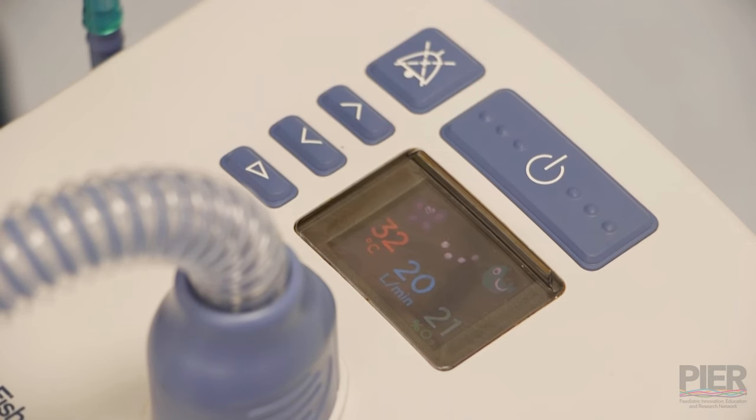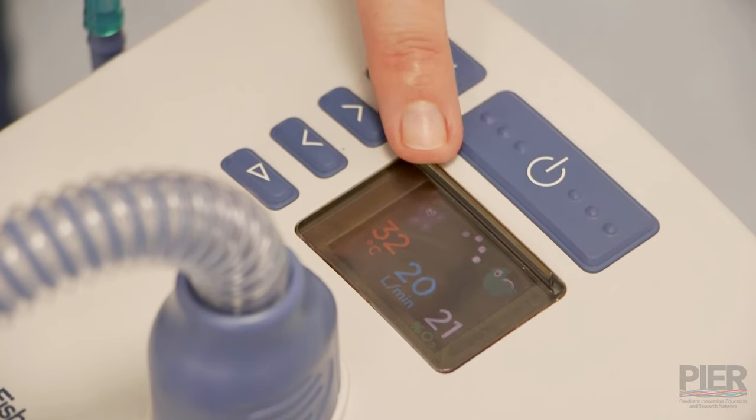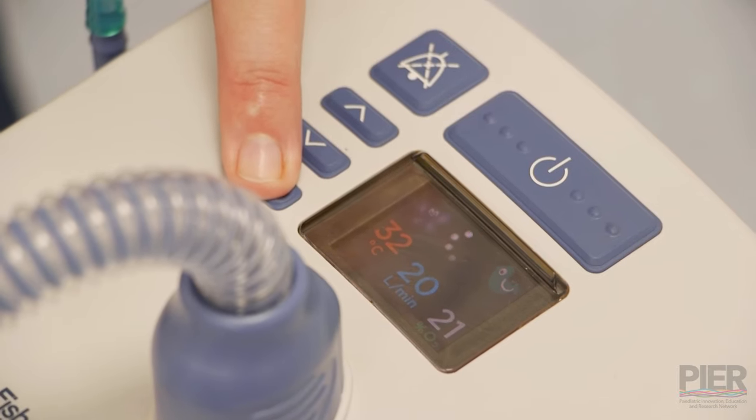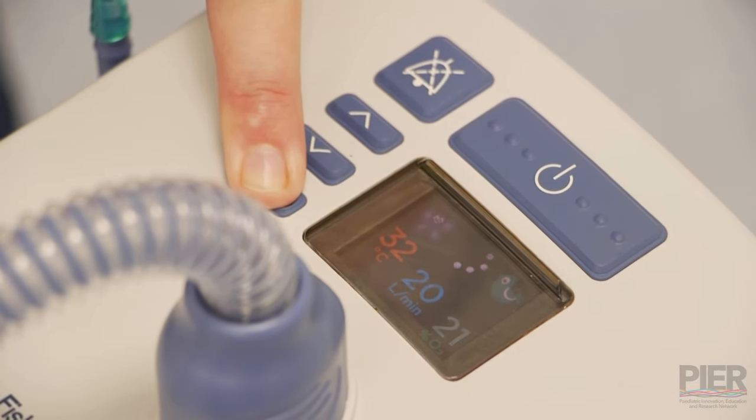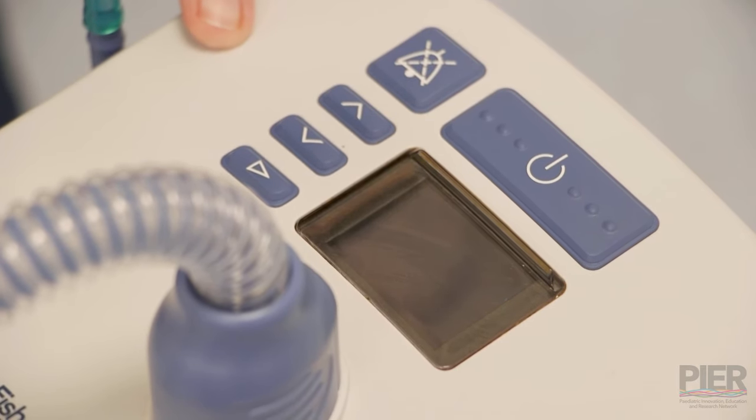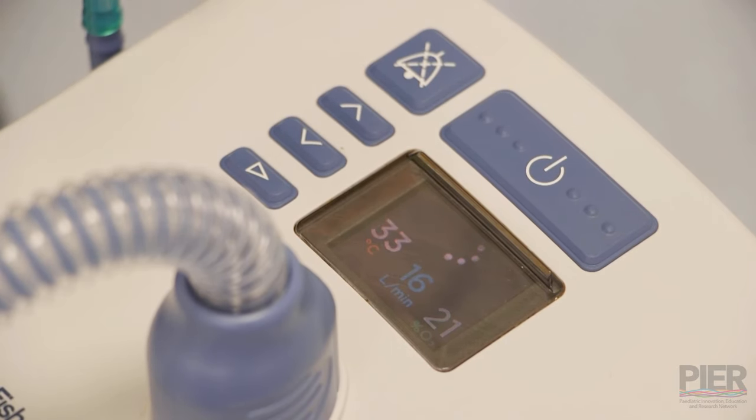If you were going to use the adult prongs, then the way to change it between the two modes, you know that you're in pediatric mode because the bird and the butterfly are on the screen. If you want to change to adult mode, you push and hold play. It will beep and then the bird and the butterfly will leave the screen. That now means that you're in adult mode and that you can now put the adult prongs on and go to higher flows.